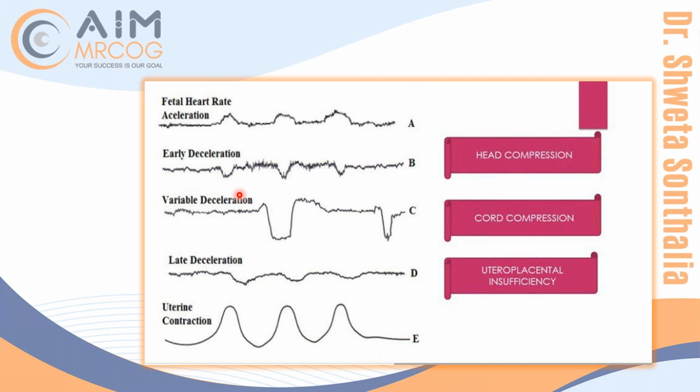When we do PV also it can happen, ma'am. Usually when you do PV, you stimulate the fetal head. Usually there will be acceleration rather than deceleration. It is a head compression, right? So late first stage, very good, Rehana. So late first stage also you can get early deceleration. But in early first stage, you will not get.